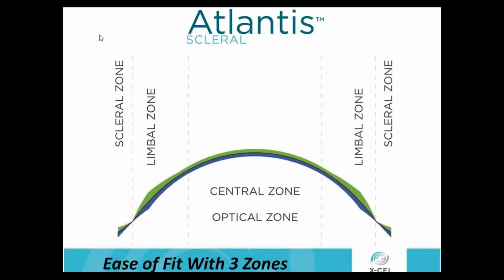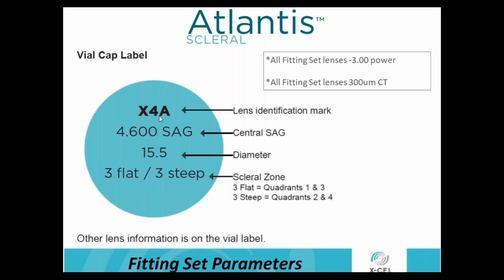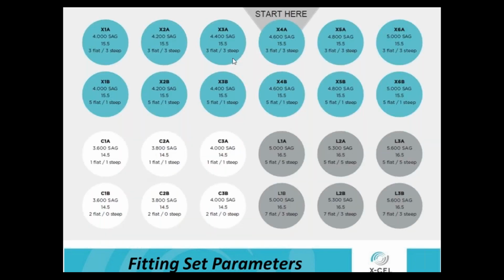So if you're looking at the cap of that lens, you can see we list the sag, the diameter, and then the edge. Well, the sag is the most important. We really don't want to think in millimeters or diopters or anything like that. We really want to worry about sag.